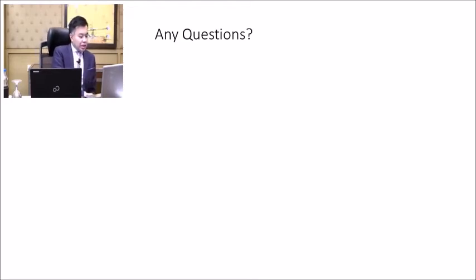So there's a question from Girish Jethwa. What is a spherical aberration range to select a patient for a Symphony? Well, it's important not to have significant amounts of positive spherical aberration. Really important not to treat patients that have had significant spherical aberration post-hyperopic LASIK, because this does not tend to give good results.